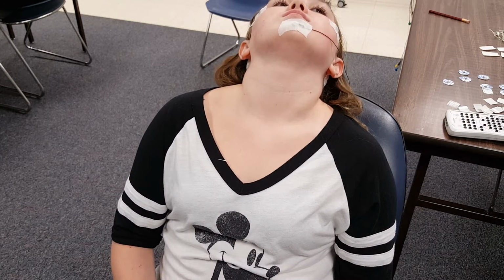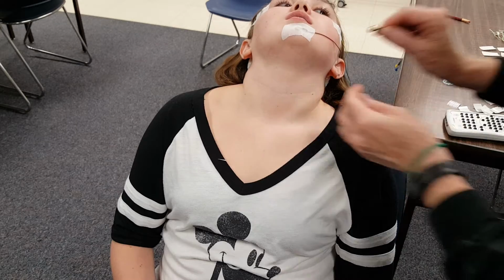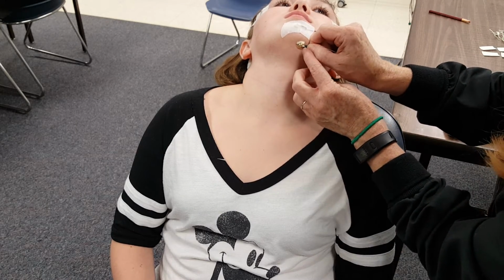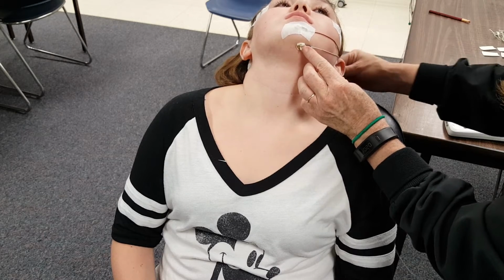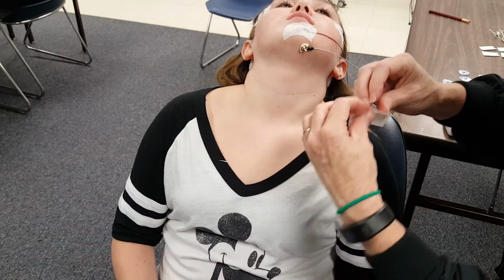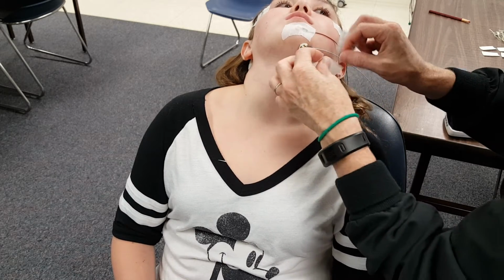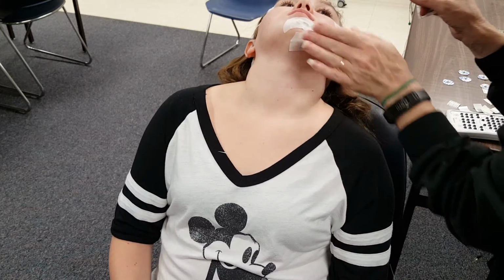At this point, your patient typically asks you, now you expect me to sleep with all this stuff on? And the answer is yes. You will go to sleep. If you remember our discussion in fundamentals class on excessive daytime sleepiness, sleepiness is not normal, and they wouldn't be here if they weren't having a problem with sleepiness. So they will fall asleep.